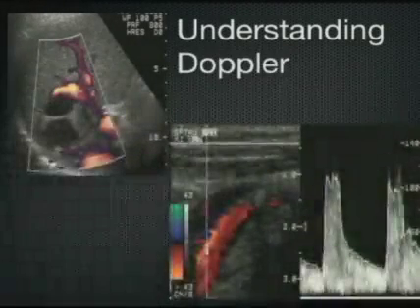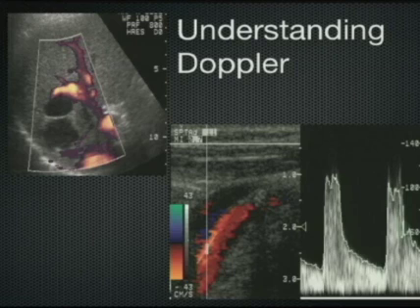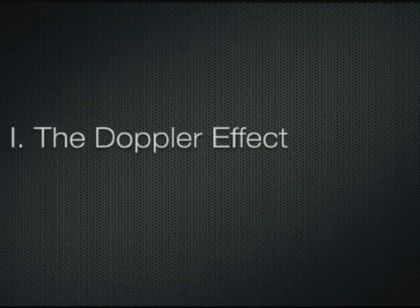Doppler is an important part of diagnostic ultrasound, and an understanding of basic Doppler principles is important in utilizing Doppler effectively, understanding and recognizing artifacts, and optimizing the quality of information obtained from the Doppler examination. The next 8 segments will review some of the basic principles of Doppler ultrasound, their applications, and important artifacts and quality control issues in obtaining accurate Doppler information. We'll begin with a discussion of the Doppler effect.